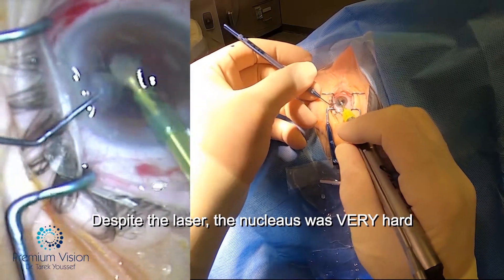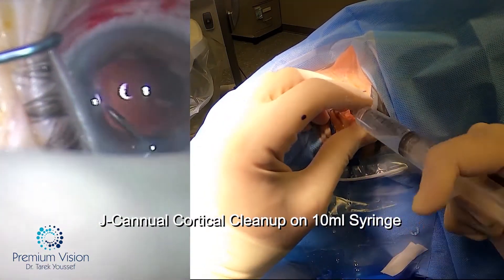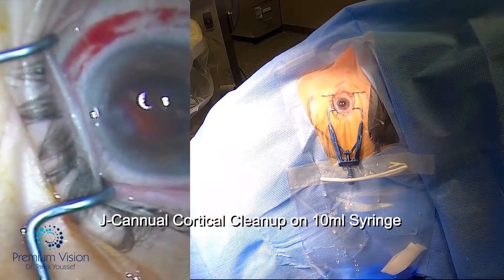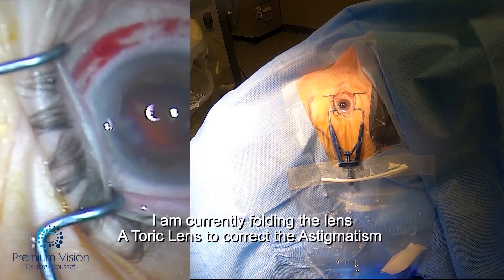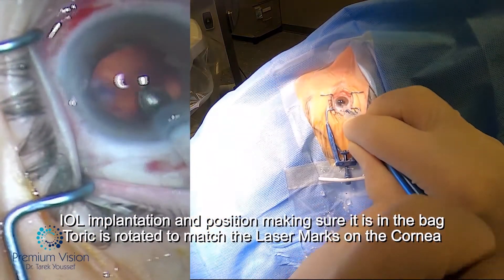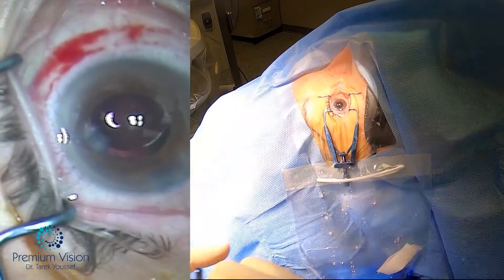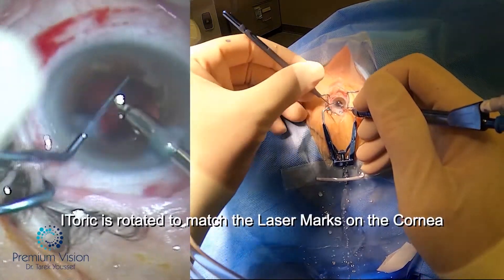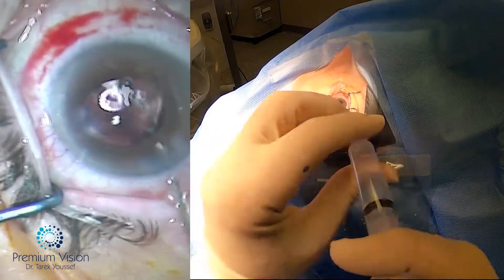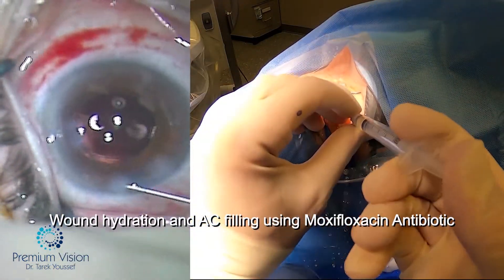The most important part is the last pieces — you have to protect the capsule because this is when you get in trouble. It's cleaned now. I'll do the J-cannula cleanup, which went well. Now I inflate the bag with Healon, load the lens — which again is a toric lens — it has to be positioned in a certain orientation. The patient's vision was 20/20 in the left eye and 20/25 in the right eye an hour after the procedure, which is amazing given that she had only perception of light before the surgery. Now hydration, rotation of the lens, positioning against the markers on the cornea, hydration of the wounds with antibiotic, injection of the sub-conjunctival, and that's it.